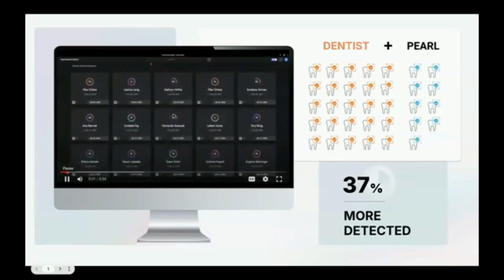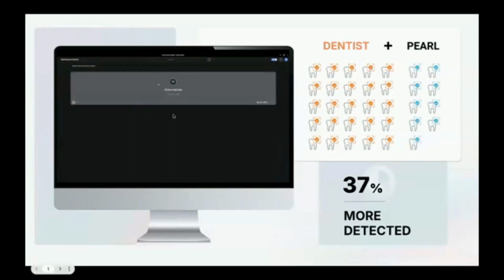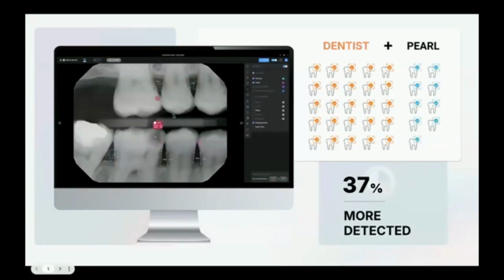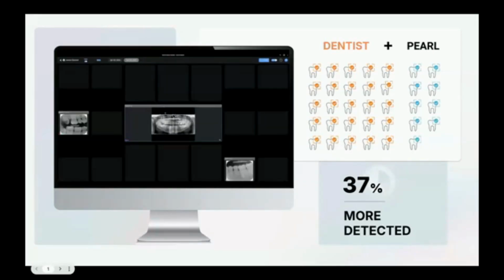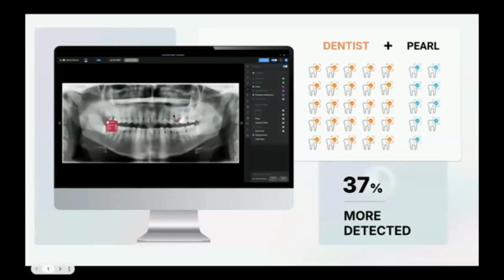Inside of having all of these things HIPAA compliant, it's also mindful to be thinking of how we can start using different products in the market, like AI, right? Having the ability to show the image that Dr. Rubinstein was talking about is really fascinating for a clinician to have that second set of eyes, similar to spell check, right? We all know how to write, we all know how to diagnose, but to have a little red line or a red dot remind you, can you take a closer look here, like number 3, especially when that patient comes in for number 30, right? And we're talking about focusing on possibly a crown or something, but an extra set of eyes that doesn't get tired, doesn't have diagnosis fatigue, is nice.